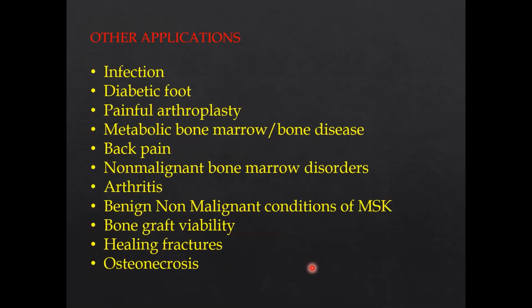Other applications are musculoskeletal infections, diabetic foot involving the different muscles and musculoskeletal structures, bones, painful arthroplasties, metabolic bone diseases, then evaluation of back pain. This is a very new, fascinating concept which has come: a patient presenting with back pain, evaluation by the PET.